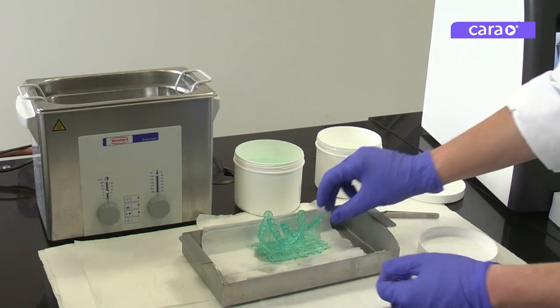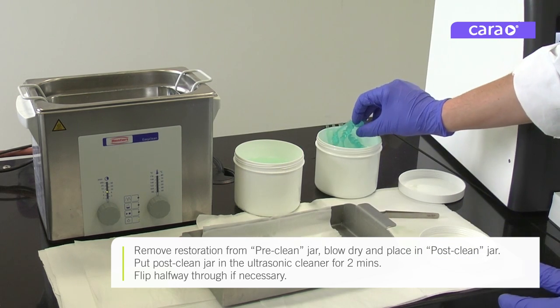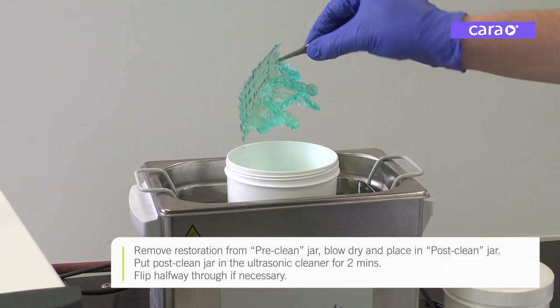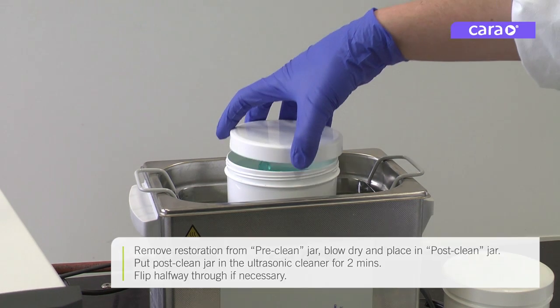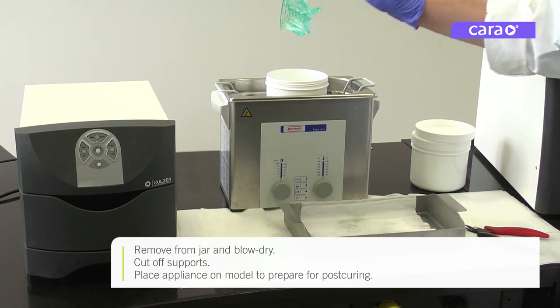Remove the restoration from the pre-clean jar, blow dry, and place in the post-clean jar. Put the post-clean jar in the ultrasonic cleaner, flipping halfway through if not fully submerged. Remove the appliance or appliances from the jar and blow dry.